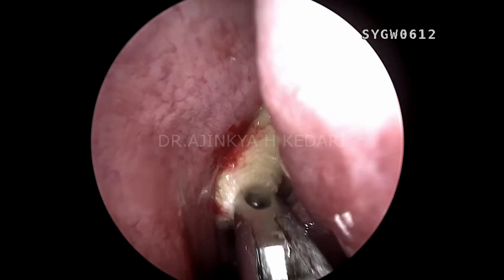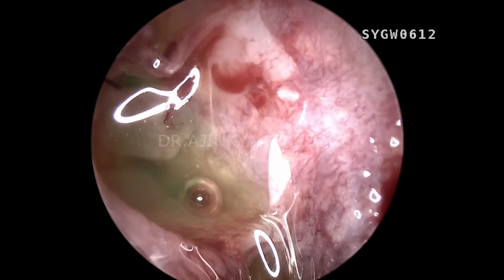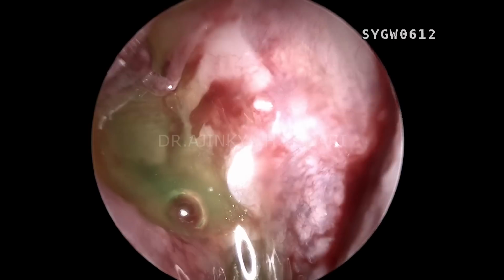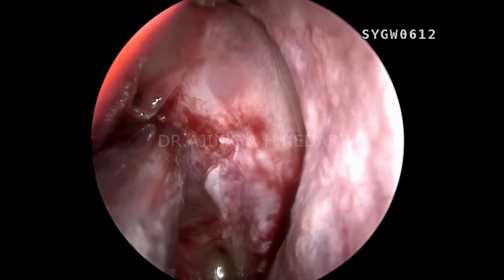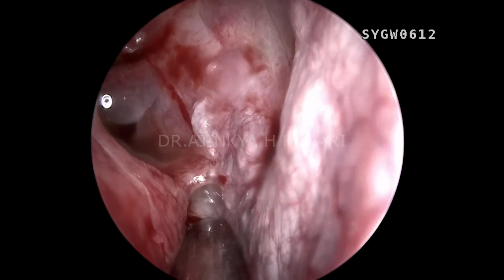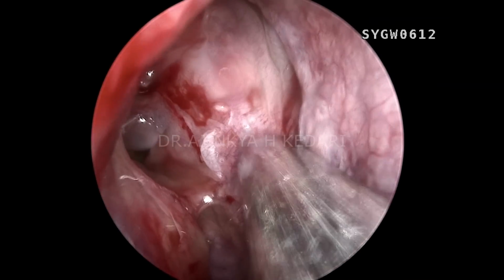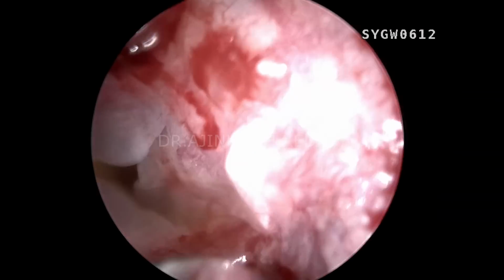Now, what you can see is a fluorescent green tinge to the CSF, and so I've asked the anesthetist to inject the patient with the fluorescein dye intrathecally. So you can see that's the CSF, and the CSF is stained with the fluorescein dye right now. So it becomes very easy for the surgeon to locate the site of the CSF leak. Where exactly I am right now is at the level of the most inferior part of the frontal recess.